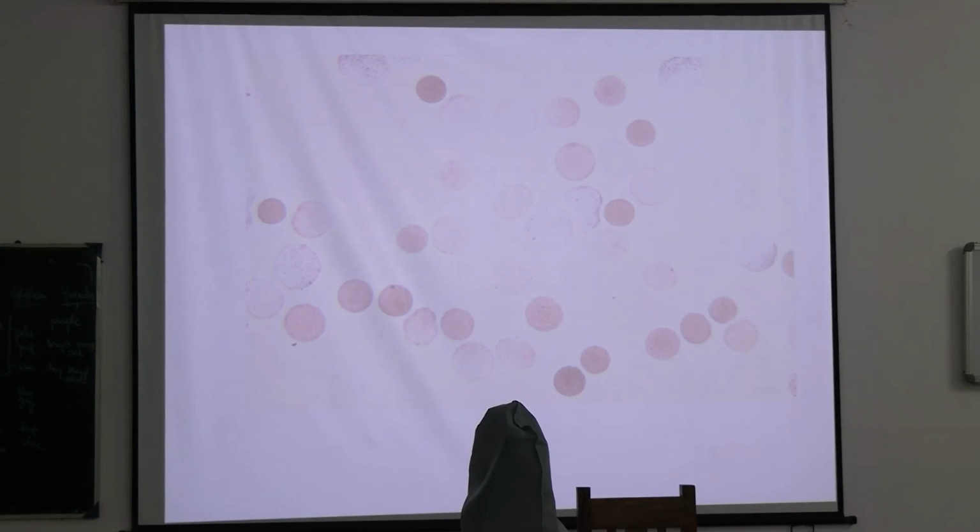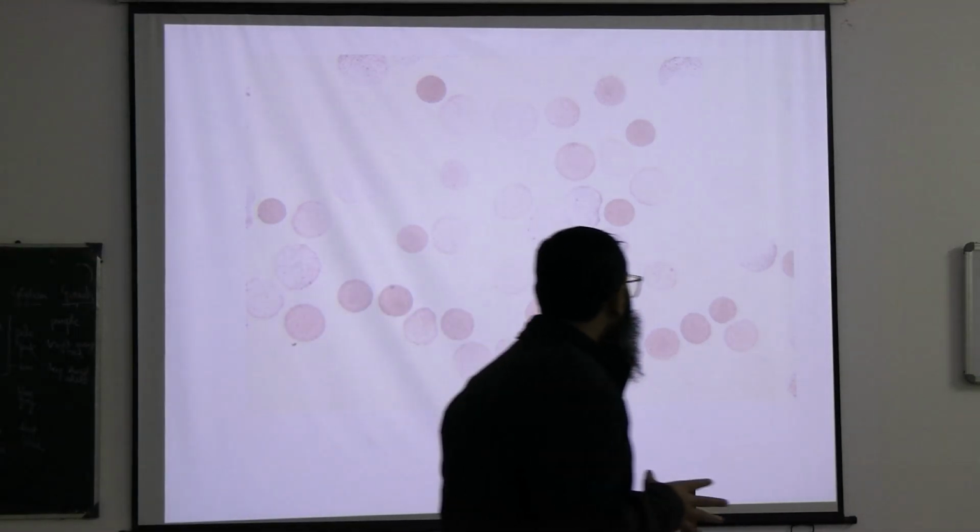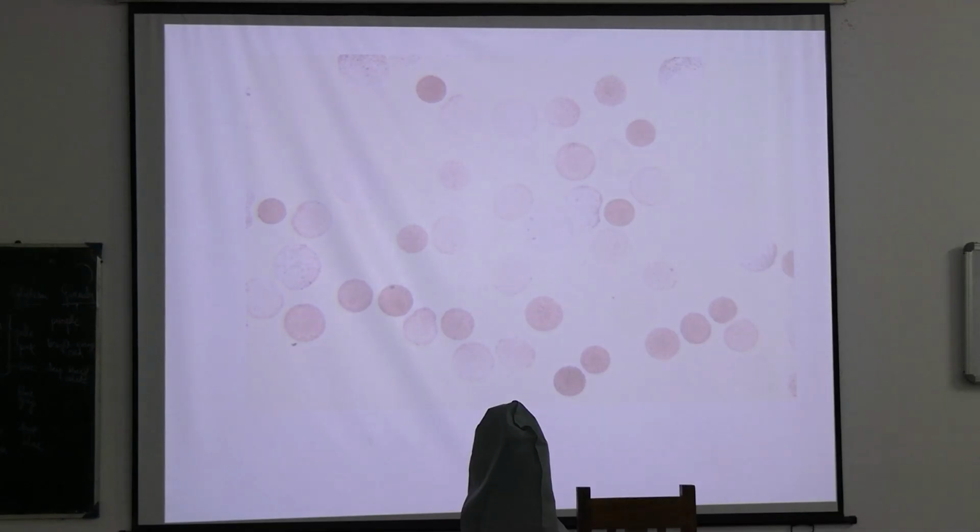So, what are these things? We never use the term hyperchromic because these things are something else. These are not the microcytic or hyperchromic RBCs. This kind of term does not exist. Can anyone guess what are these cells, which have lost their central pallor?